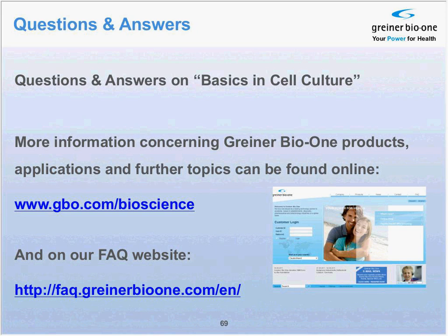I do not know of any reports that show them really add to purity in your cell culture lab. So yes, 70% alcohol is fine. Ethanol is fine.